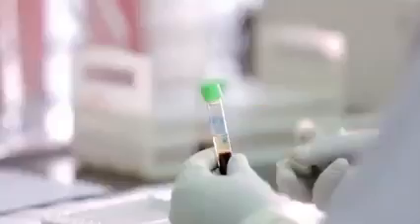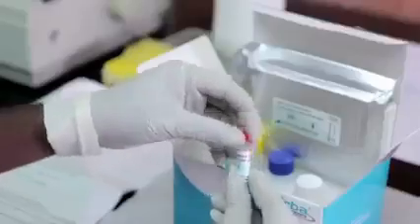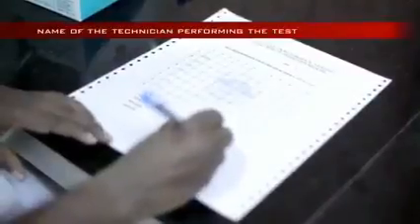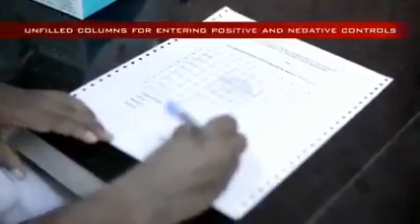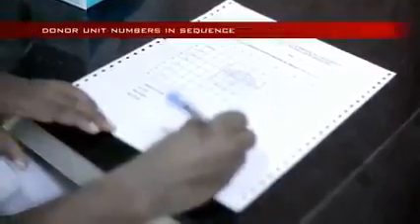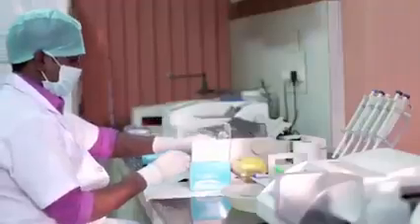Preliminary measures. Sample identification is done by cross-verifying donated blood unit numbers with corresponding pilot tubes containing serum. Check the reagent kits for lot numbers, expiry date and any visible abnormal changes. Prepare worksheet with particulars such as name of the test, date of testing, reagent lot number and expiry date, name of the technician performing the test, signature of officer in charge, and unfilled columns for entering positive and negative controls, and donor unit numbers in sequence. Always adhere to manufacturer's instructions.